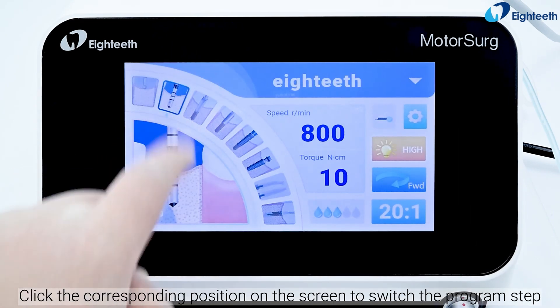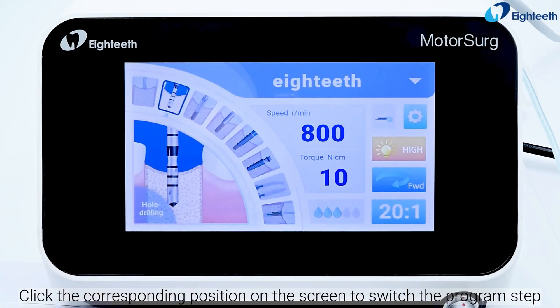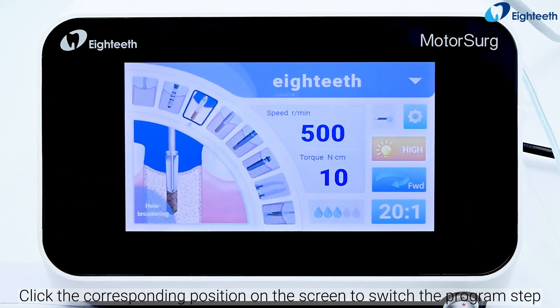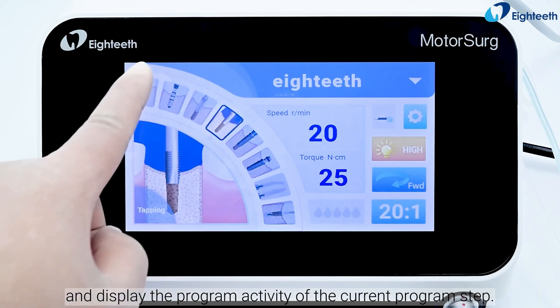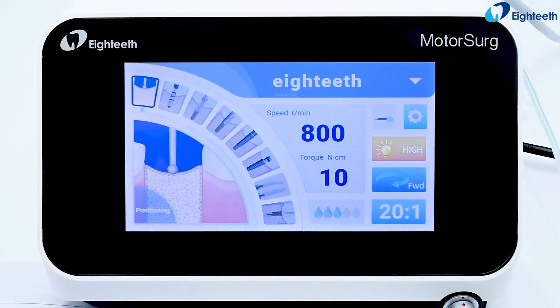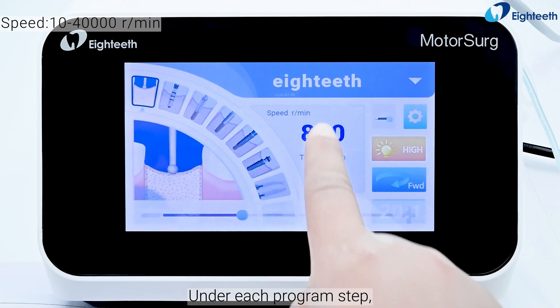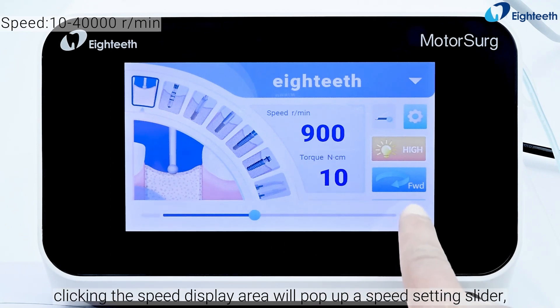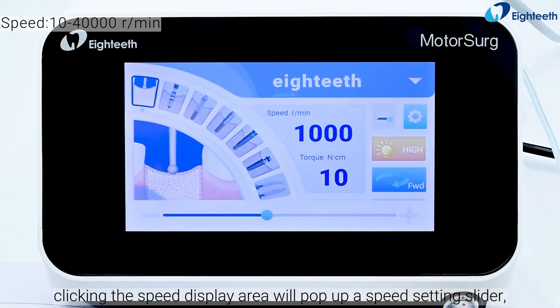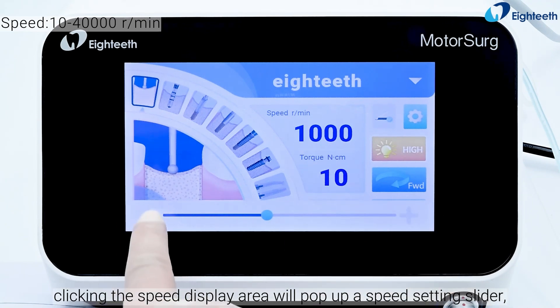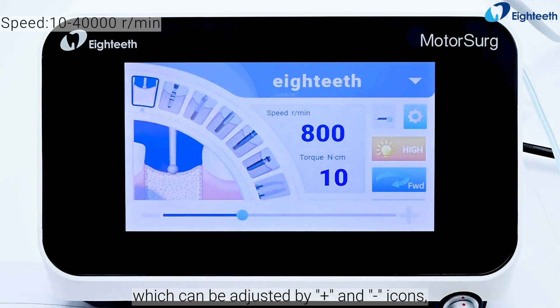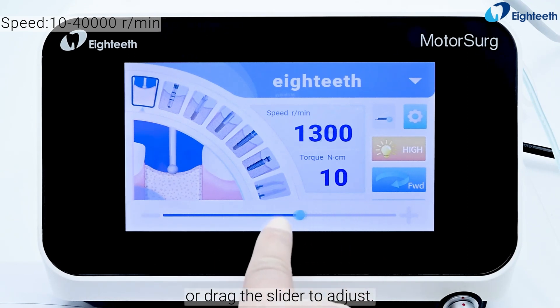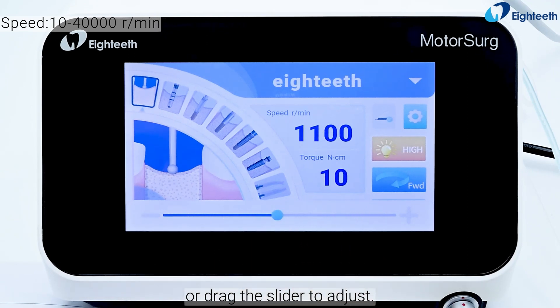Click the corresponding position on the screen to switch the program step and display the program activity of the current program step. Under each program step, clicking the speed display area will pop up a speed setting slider, which can be adjusted by plus and minus icons or by dragging the slider.